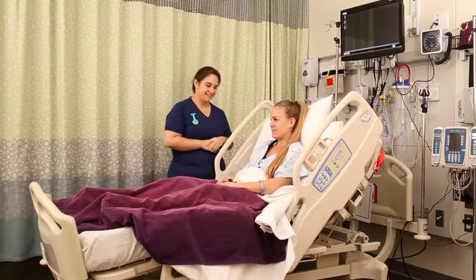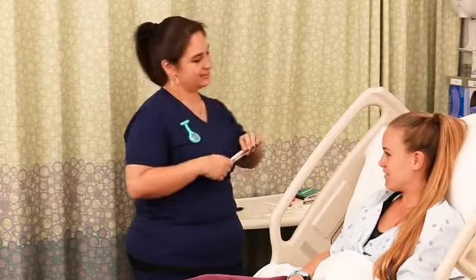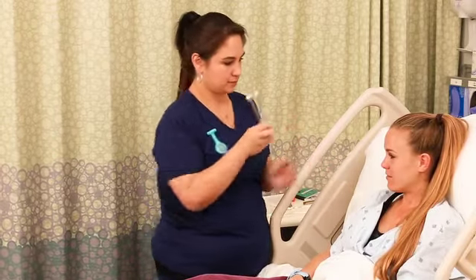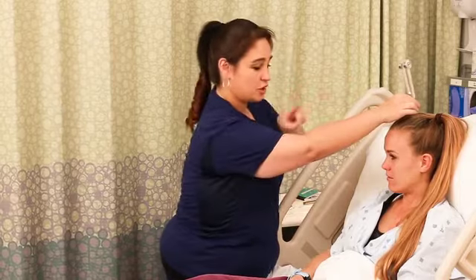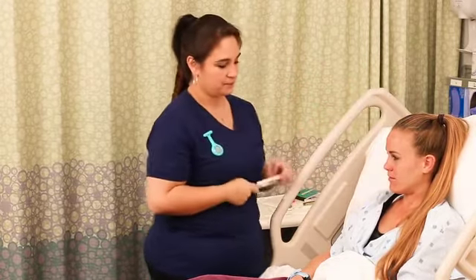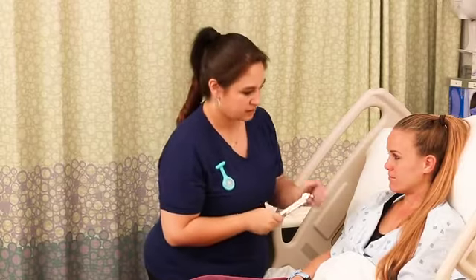Next, you're going to move on to the Weber and Rinne tests. For that, you need a tuning fork. The Weber test tests bone conduction for hearing. So strike the tuning fork and put it on the top of the patient's head. Ask the patient if it sounds the same on both sides. We want to know how well the sound moves through bone.